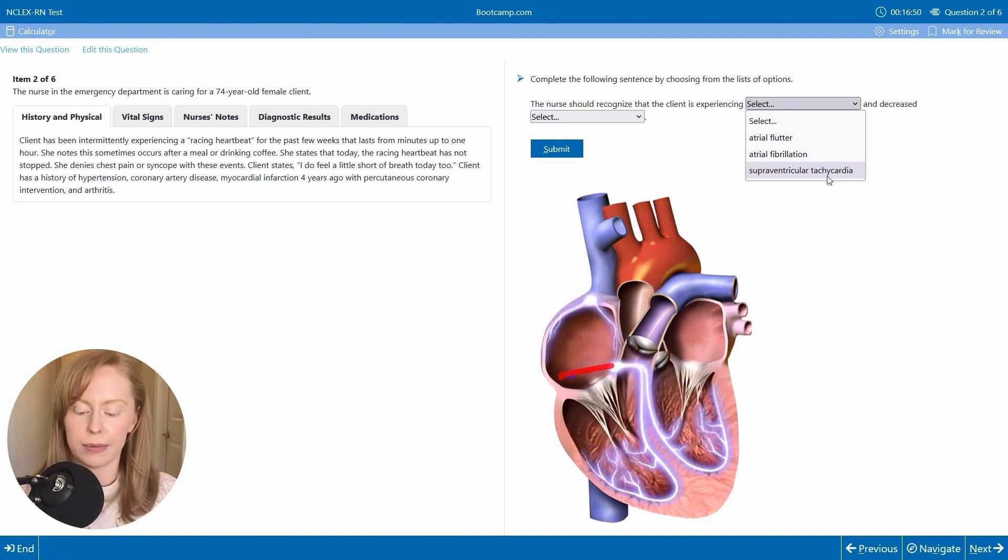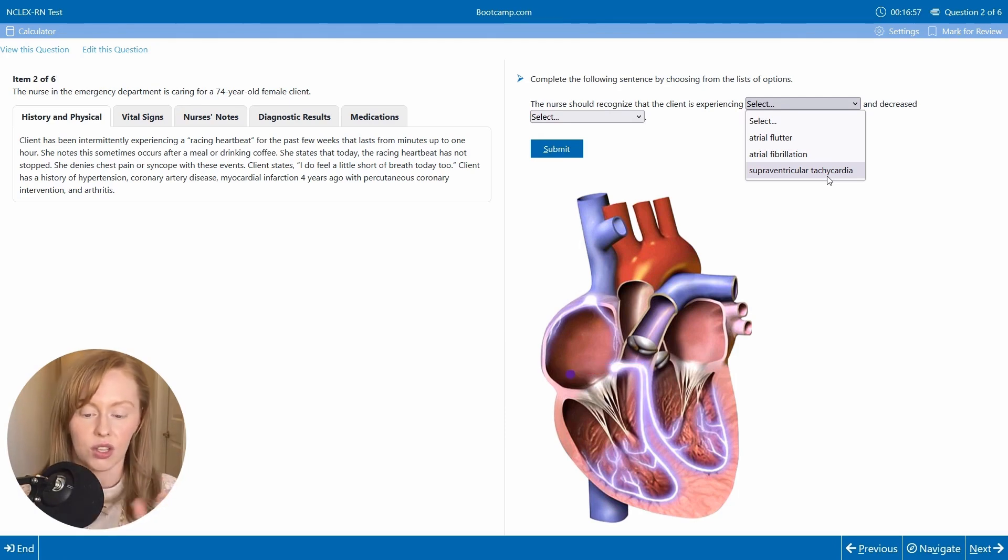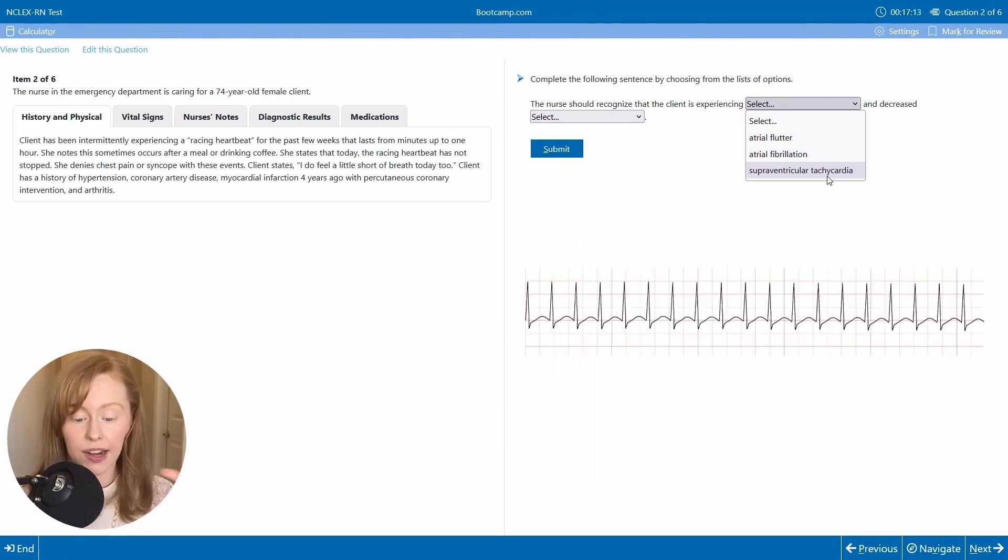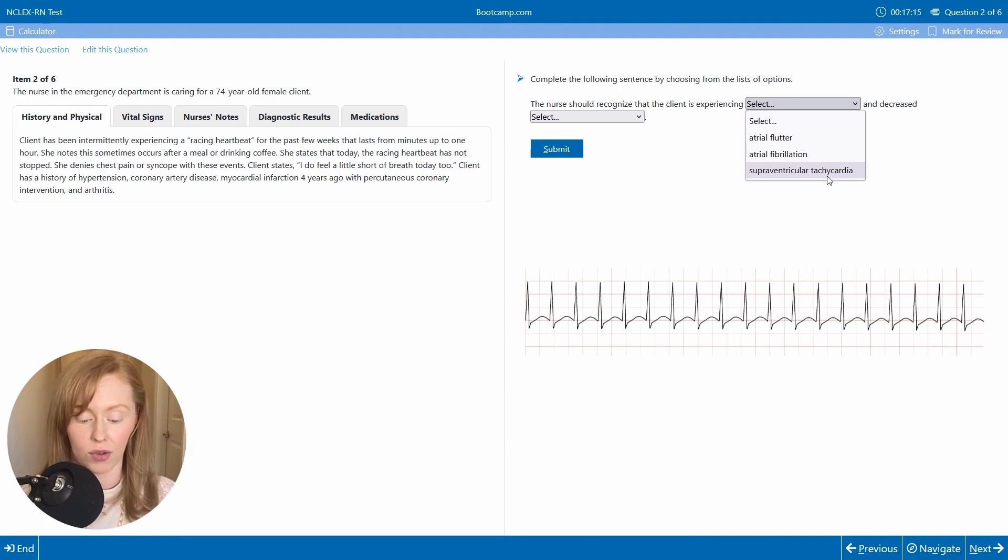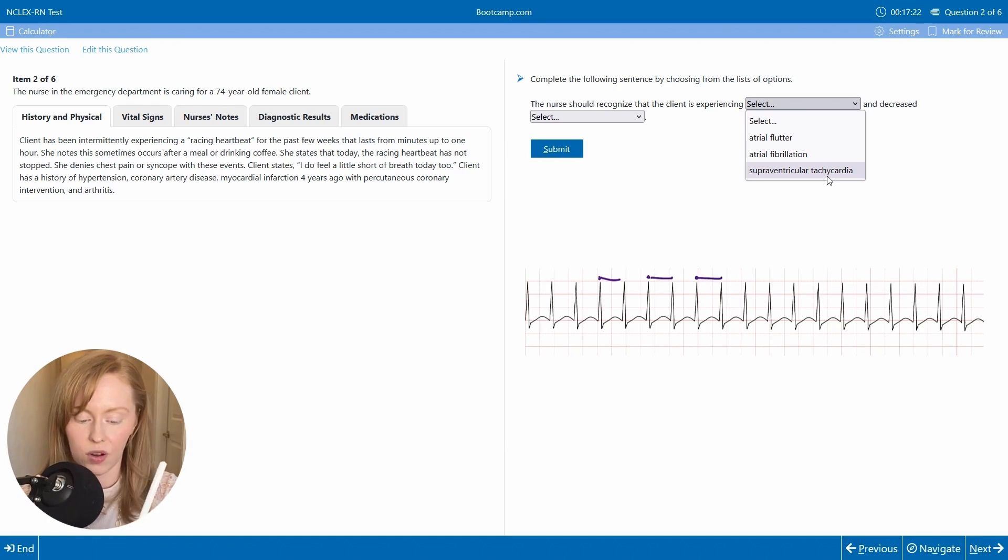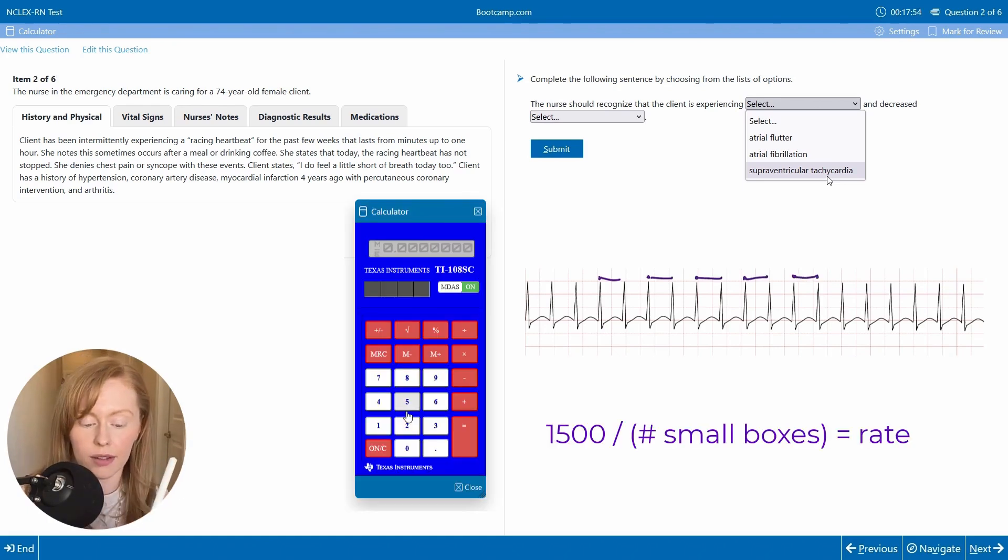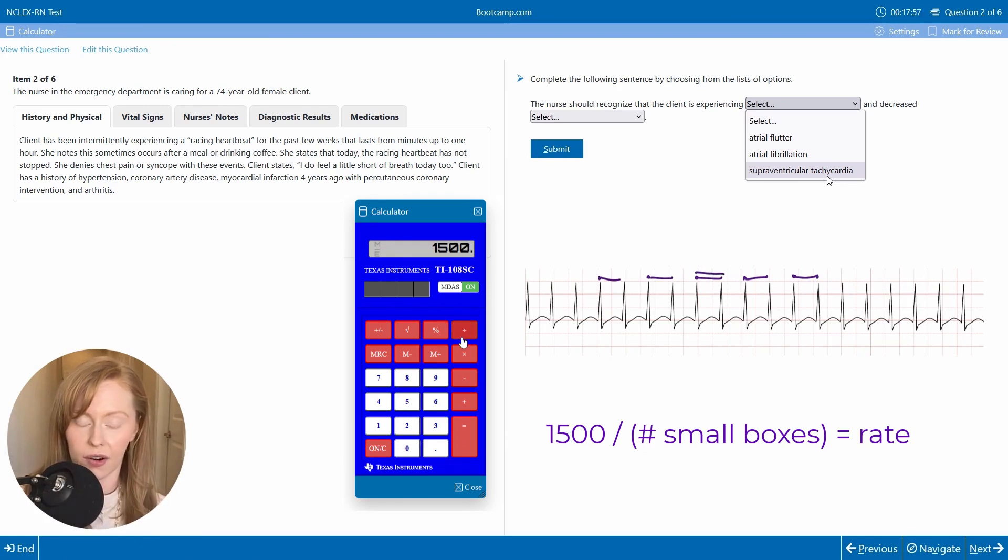And so it's rapidly firing impulses to your AV node. So it's very rapid and it's very regular. So you see, I have the same distance between each one of these R to R intervals, only about seven small boxes between each of these R to R intervals.